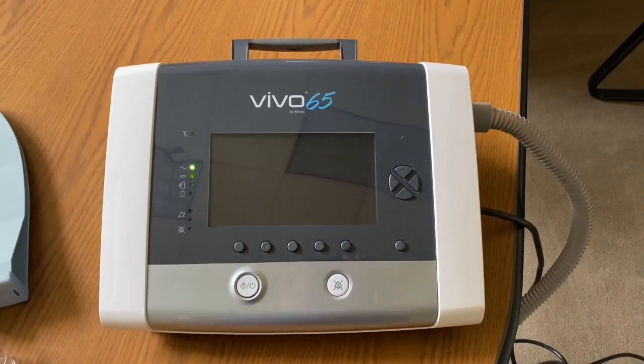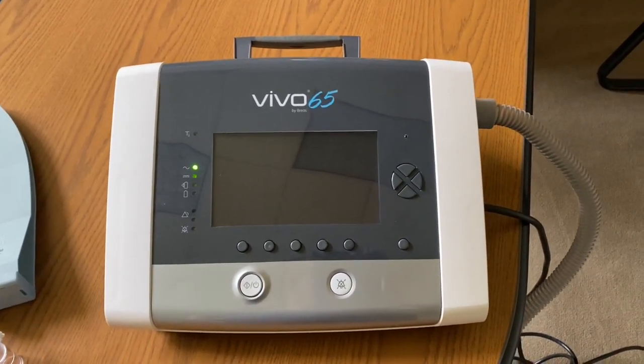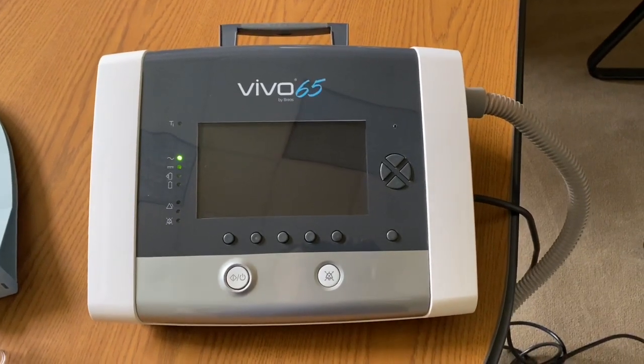This is the Vivo 65 ventilator. It's manufactured by Breas. This video will show you how to use the ventilator.